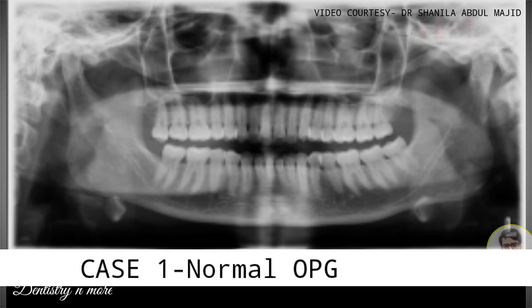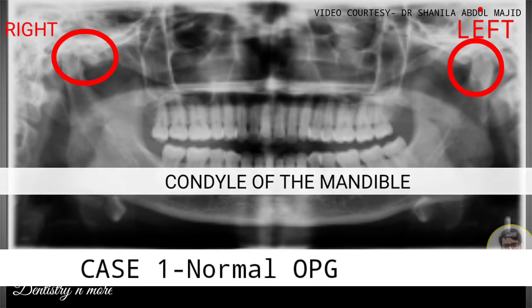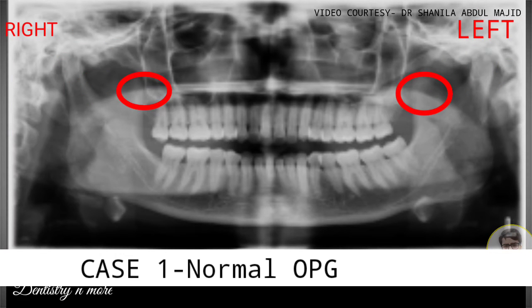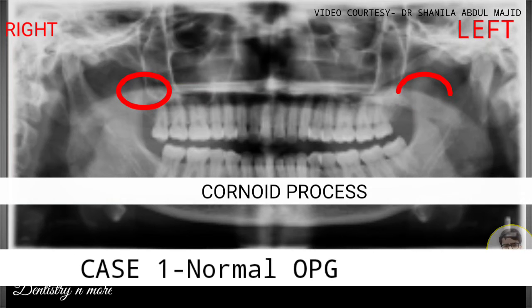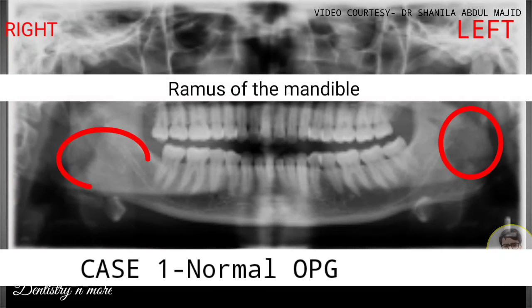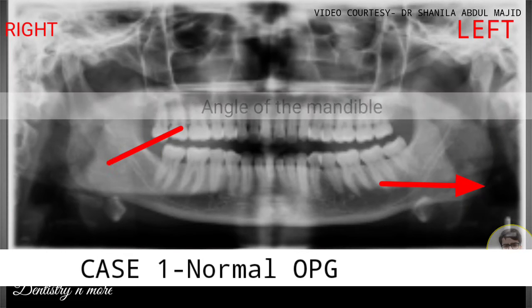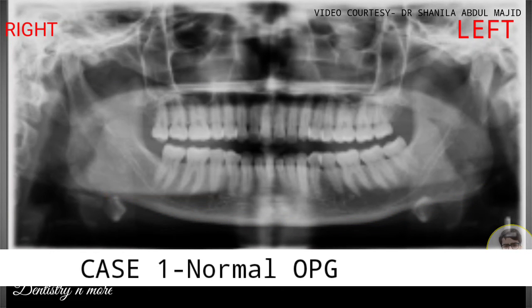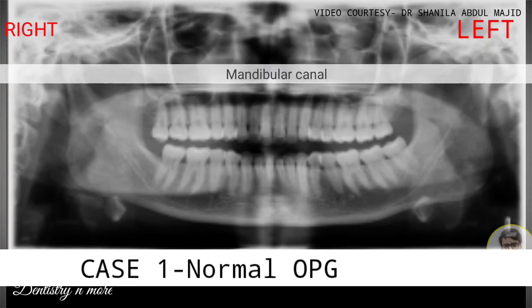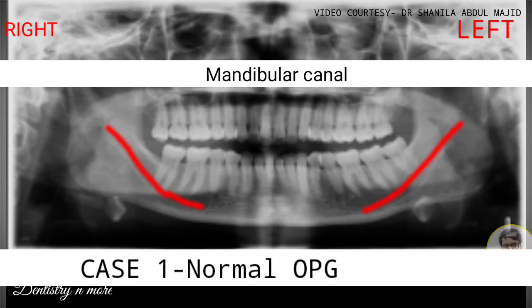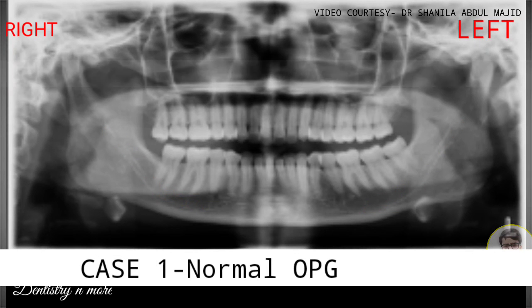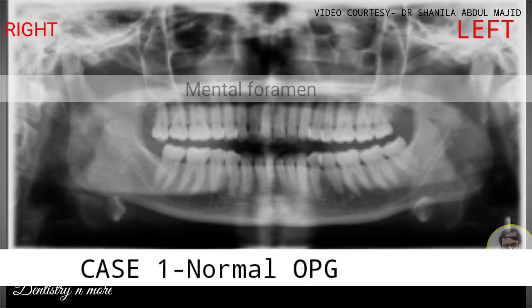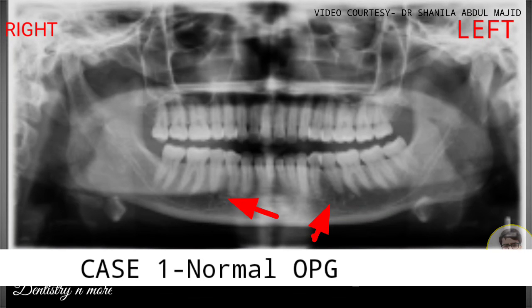First and foremost you see the condyle of the mandible, followed by the sigmoid notch and then the coronoid process. Below the condyle we have the ramus of the mandible and then the angle of the mandible, followed by the inferior border of the mandible. Within the ramus you can see a radiolucency canal — that is the mandibular canal — which terminates towards the second premolar, or in some cases between the mandibular premolars, which is the mental foramen.